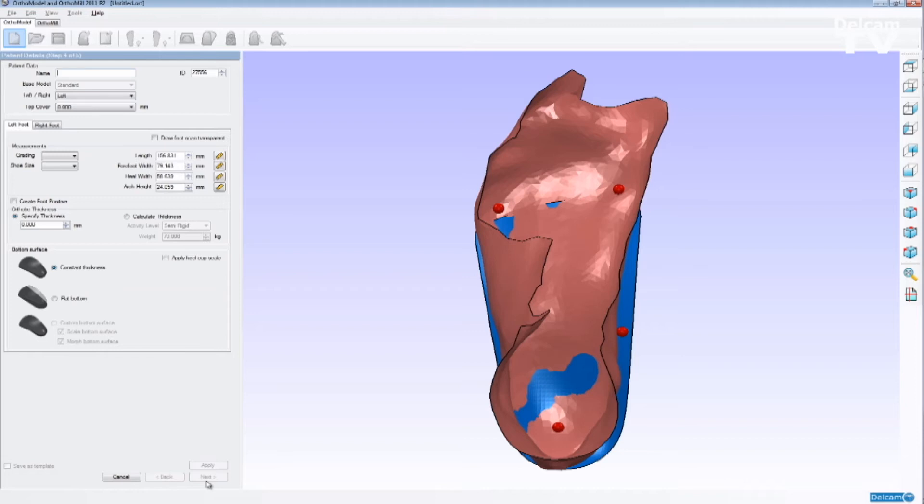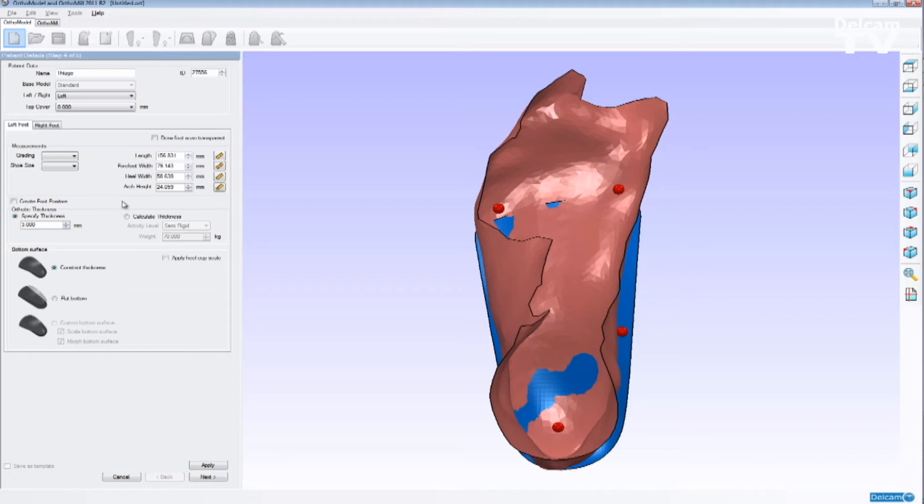Once OrthoModel finishes designing the orthotic, it takes us to the patient's detail page, where we can enter the patient's name, the orthotic thickness, and also do some more fine tuning. But the user is also able to modify these values, as you can see on the menu here.